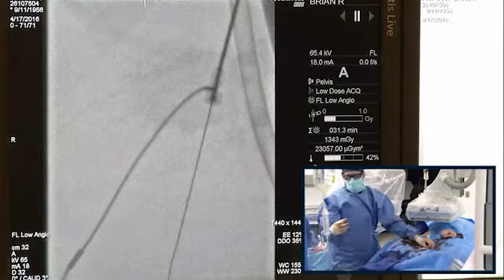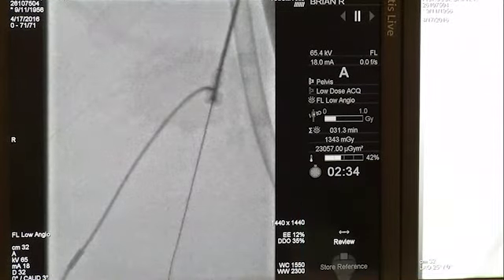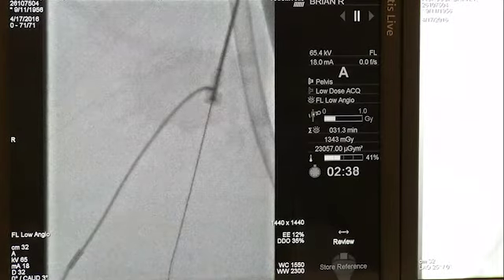Give me the dilator for the 7 French sheath. So now he has a tethered wire, and that gives him profound support. He's going to be able to push pretty much anything over that, regardless of how long or how tight. And it negates this loss of vector force at the aortic bifurcation, where the natural vectors want to go cephalad.